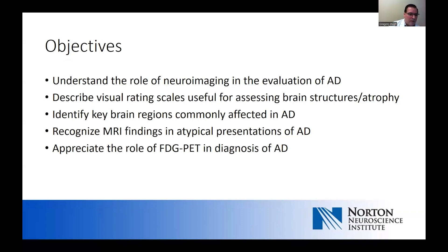We'll talk about MRI findings and atypical presentations of Alzheimer's disease, which are much more common particularly amongst younger patients who present with early onset Alzheimer's. And then briefly at the end, we'll talk about functional neuroimaging. We won't talk about amyloid imaging in this talk — that will be part of the biomarkers session.